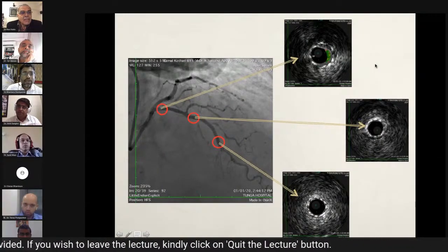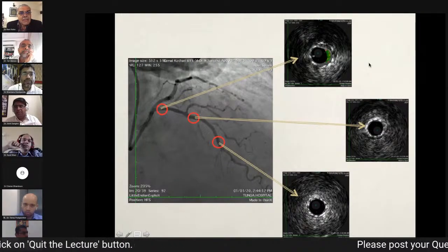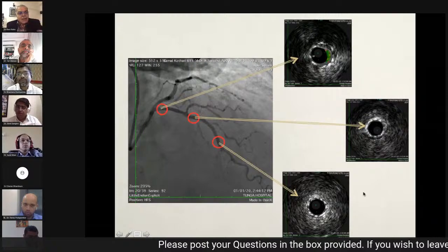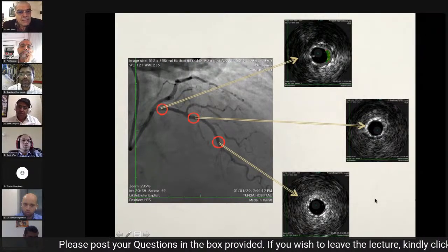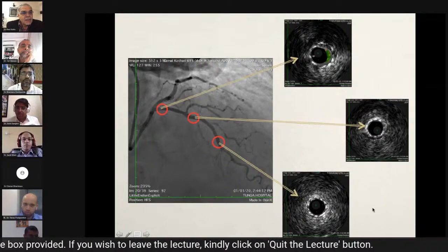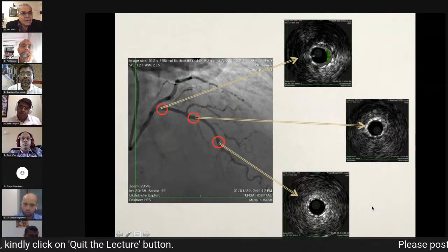Actually, you can calculate MSAs. Actually, MSAs are more important. So proximally, I think the MSA was about 9 or so. I actually don't remember, and unfortunately now I couldn't go back and retrieve the CD again. So I don't know the calculation of this vessel there. But the proximal was more than 9. That much I remember clearly.